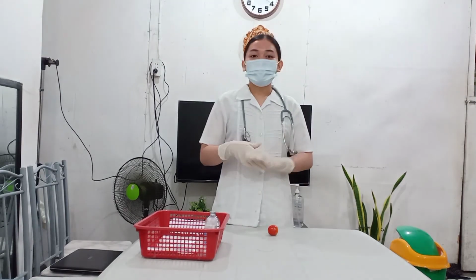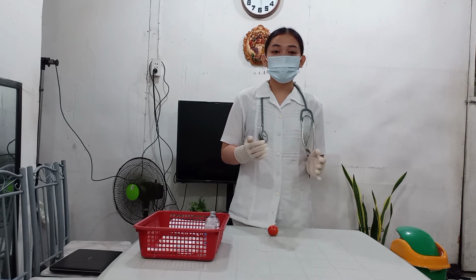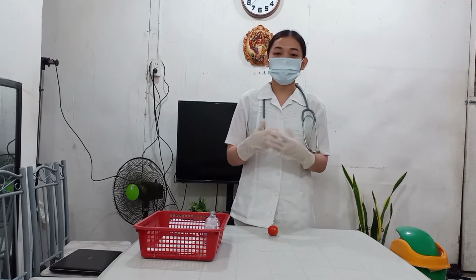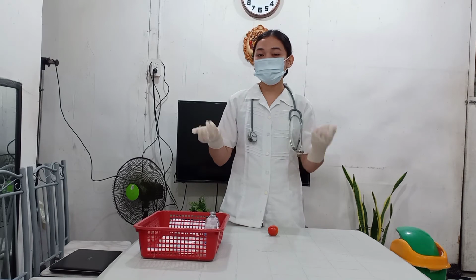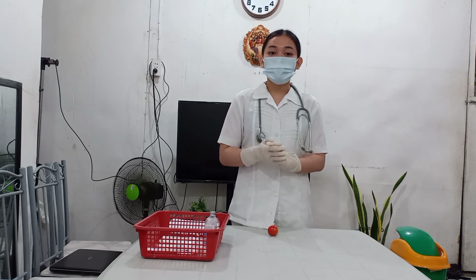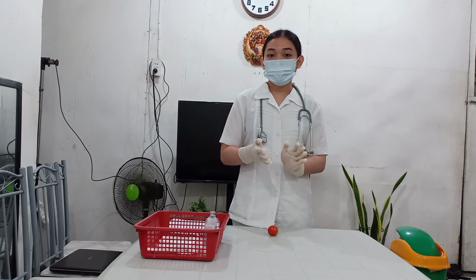So, now, let's begin with the first step, which is to perform hand hygiene and observe the appropriate infection control procedures. This is to prevent contamination and possible transmission of microorganisms. So again, since I've already completed washing my hands and donning my gloves, I will then proceed to the second step, which is to prepare the medication from the vial or ampule for drug withdrawal. Because organization of necessary items for the procedure facilitates accurate skill performance.